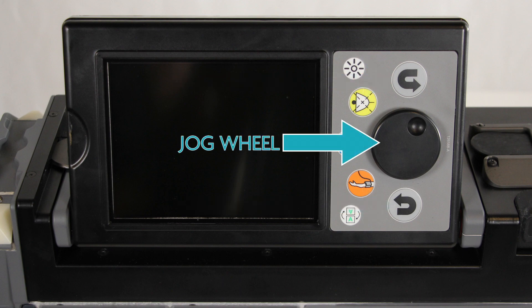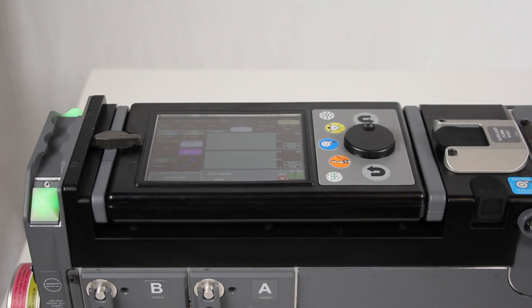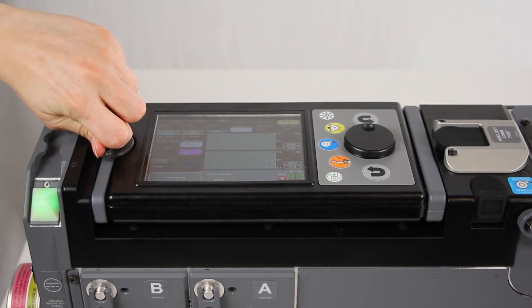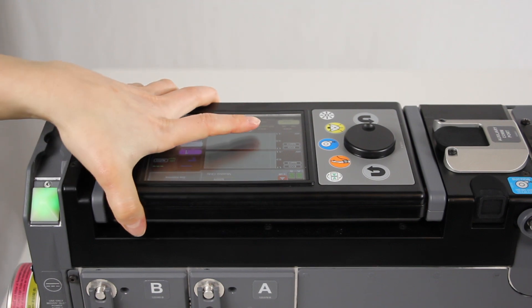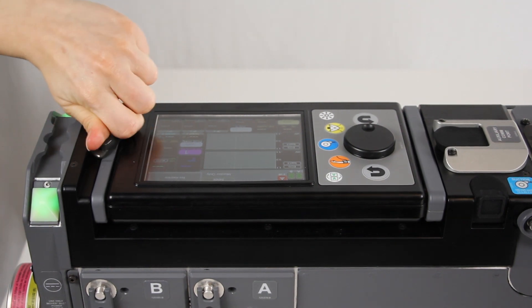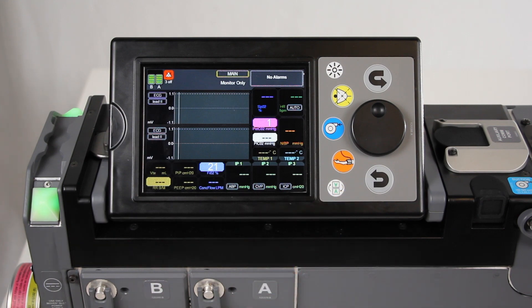Turning the jog wheel clockwise or counterclockwise selects an item in a circular manner going around the screen. Activate the selection by pressing the jog wheel. Press the back button to cancel an active entry. The display screen can be locked or adjusted to face either the right or left side of the MOVES SLC to support operation from either side of the unit. Turn the catch 90 degrees to the left or right to unlock the screen and allow it to be raised into a working position. Use the flip screen button to adjust the display orientation as needed.